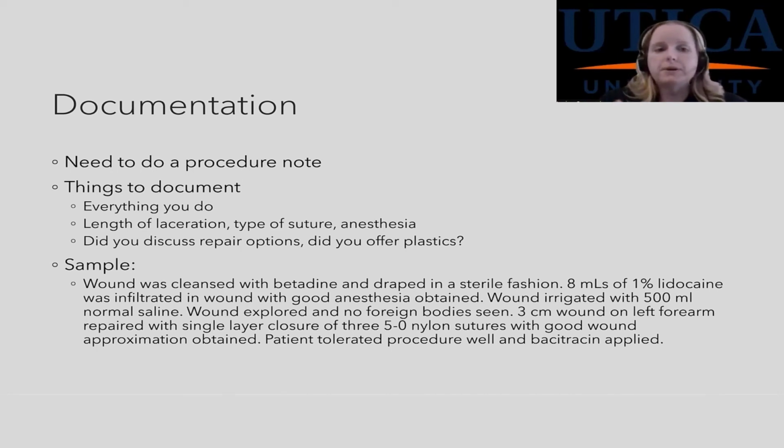Some other things that are very important: the length of the laceration. If you're doing a laceration, the length is very important, so absolutely document the length. Also the types of suture you used, the number of sutures you placed, and any anesthesia you used. Did you discuss any repair options or offer plastic surgery, especially if it's a facial wound? I placed a sample here. You can see that there. Again, this is very important.